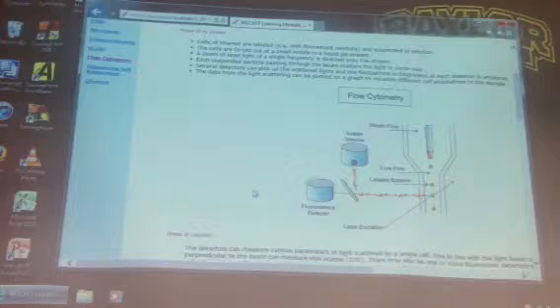And let's say there is a surface antigen on a particular organism. I don't know, let's pick Salmonella, or maybe Giardia, your favorite pathogenic microorganism. You take an antibody against that surface antigen, and then you take your Lake Waco water and add the antibody, and the Salmonella is all fluorescing because it has that fluorescent antibody on it.